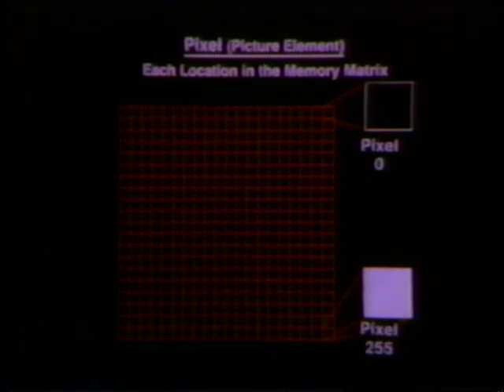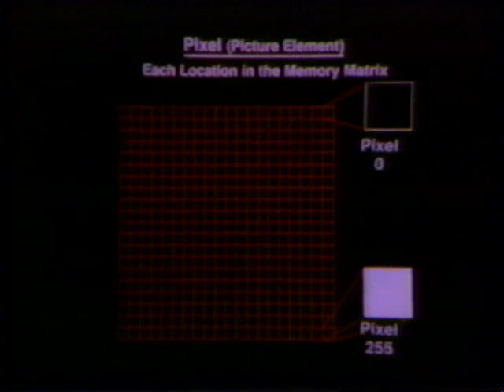Depending on what type of film is used to record the image, the scale can be reversed, making the 0 value represent white and the 255 value represent black. Numerical values between 0 and the maximum stored value are assigned values between 0 and 255. In this way, an image is created that has 256 different shades of gray, ranging from black to white.